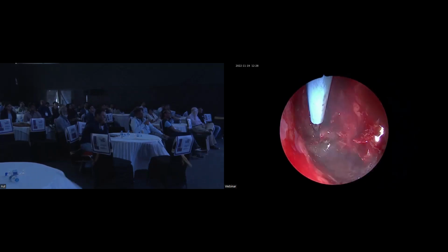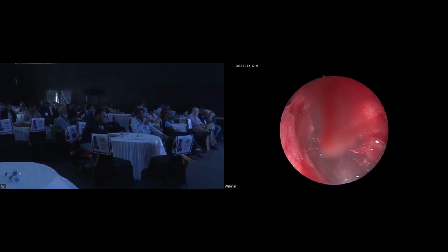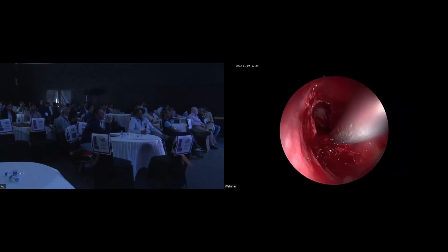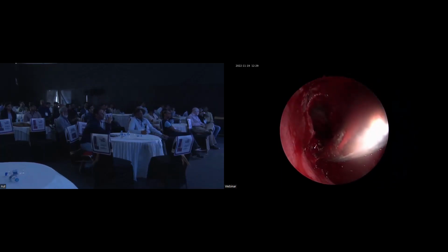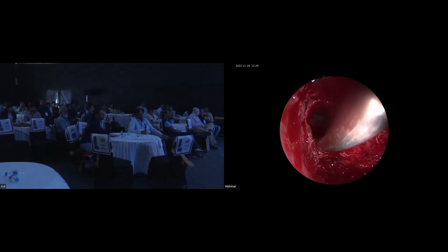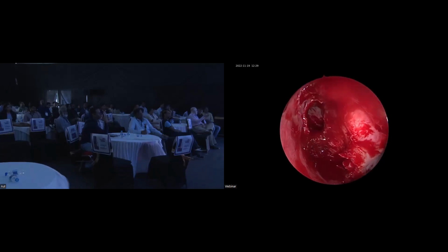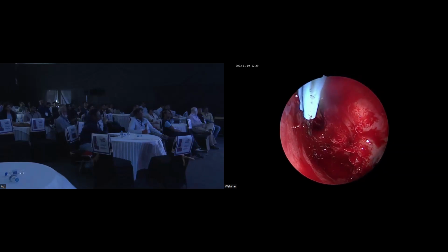Whenever you have little bleeding in the area of the anterior ethmoidal artery, you make sure that you use only the bipolar. Just clean the tip, please. And with little irrigation. Can I have the bipolar again, please? And it's never the whole bleeder. It's always a puncture mark on the anterior ethmoid which can give you the bleeding.